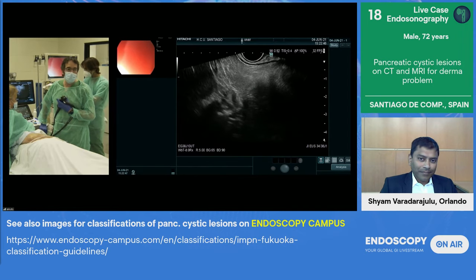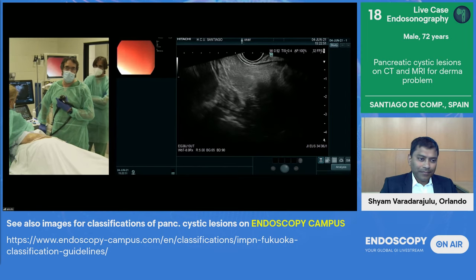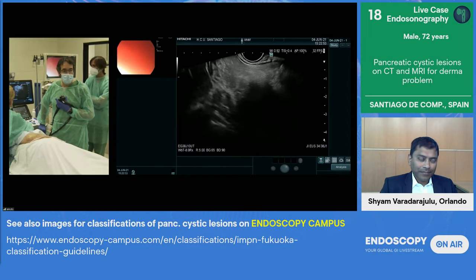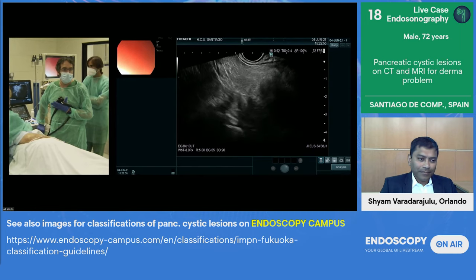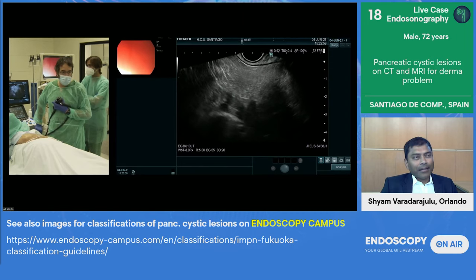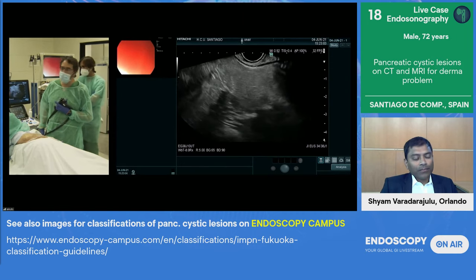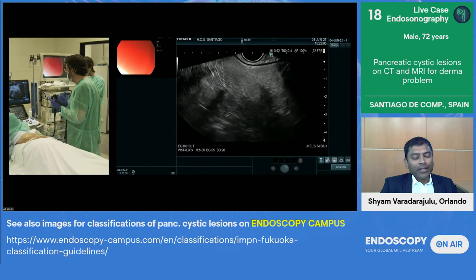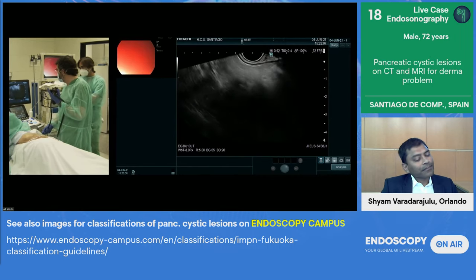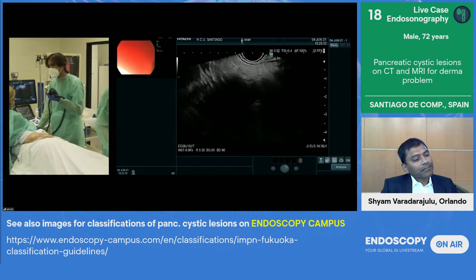And probably if we're able to detect that there is a low malignant potential, probably I will be more confident with this almost 4 centimeter lesion, even to try to keep it under surveillance instead of talking to my surgeon. So we're working with them very strongly, and we will try. But if not, we will just switch to a 22. So I will let Jose, because he's the one we usually work together with, while I'm explaining what we're going to use.